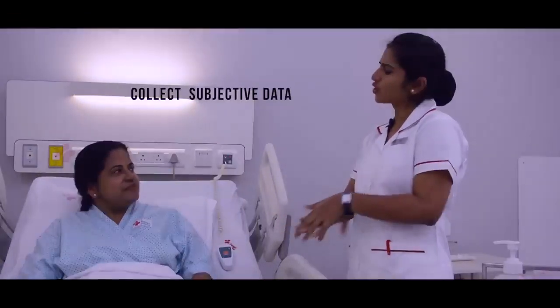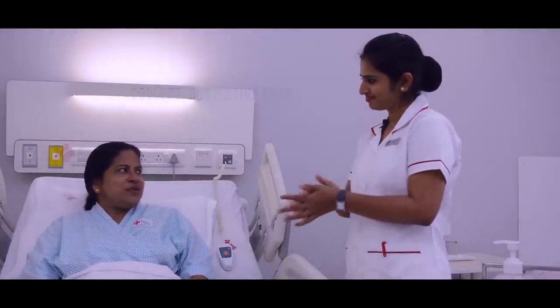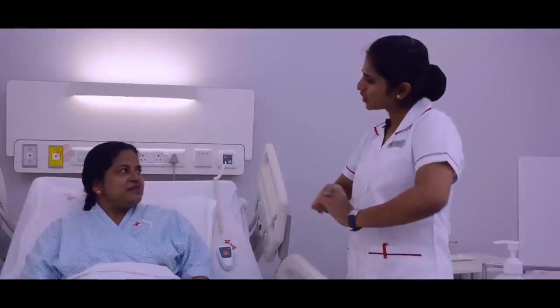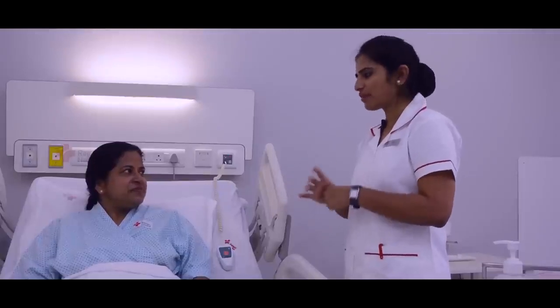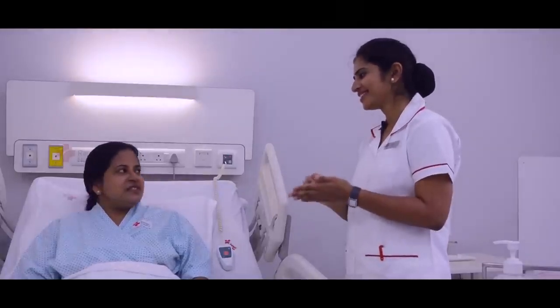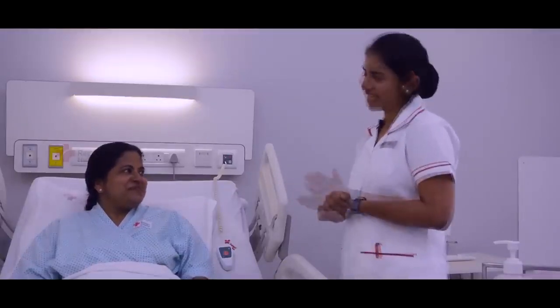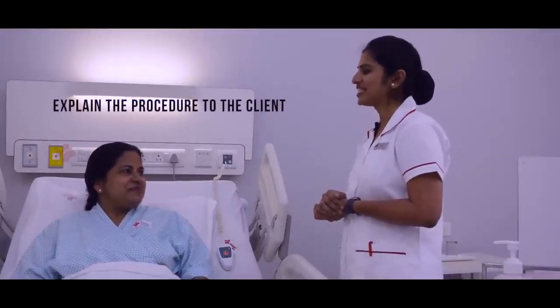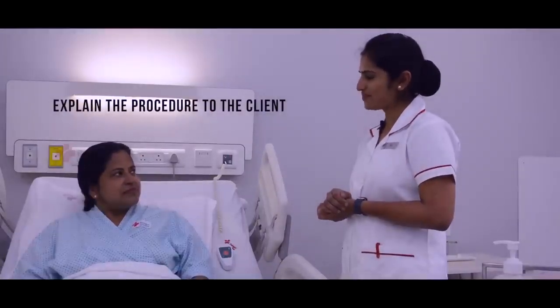Ma'am, if I give you a pain score of 10, how would you rate your pain then? At present 0, no pain at all. Do you feel any chest discomfort or breathing difficulty? No. Okay, ma'am, would you please tell me the date and time of today? Today is 26th December 2018 at 10 a.m. Okay, now I am going to check your vital signs that include temperature, pulse, respiration, blood pressure and pain.